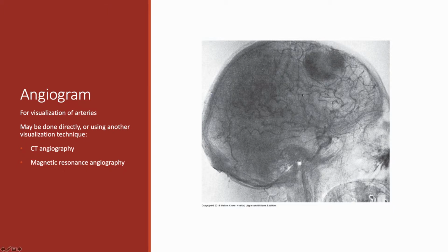It's kind of like the negative. And so that negative gets shown here, and those images now are reversed. So any vessels that have dye in them show up as black instead of white.